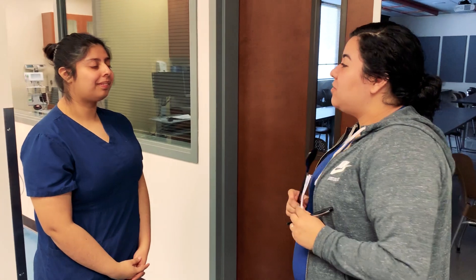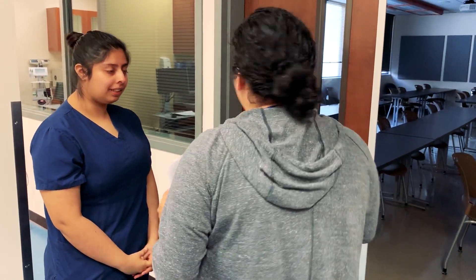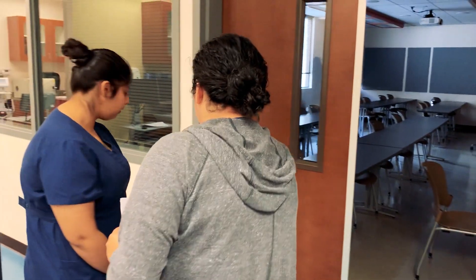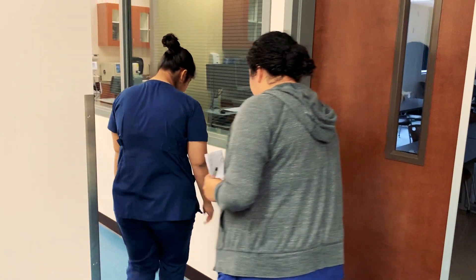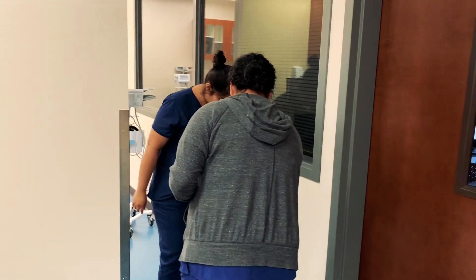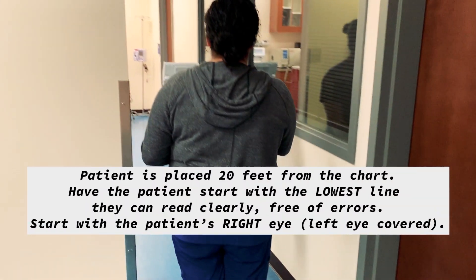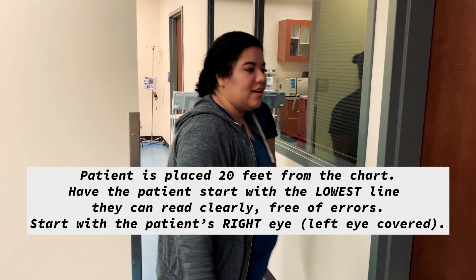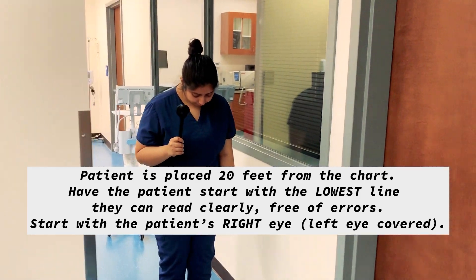Hello, today we're going to be doing a visual acuity test, which is right down the hall. I'm just going to ask you to step right here where the tape is. Right here? Yes, right here. You hold on to this. Okay, and then let me just walk down here.